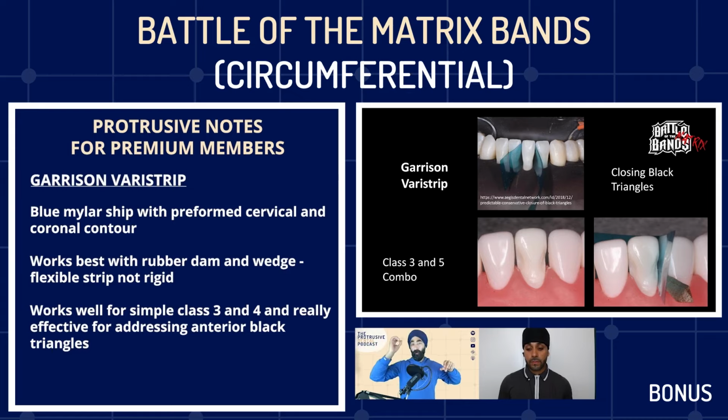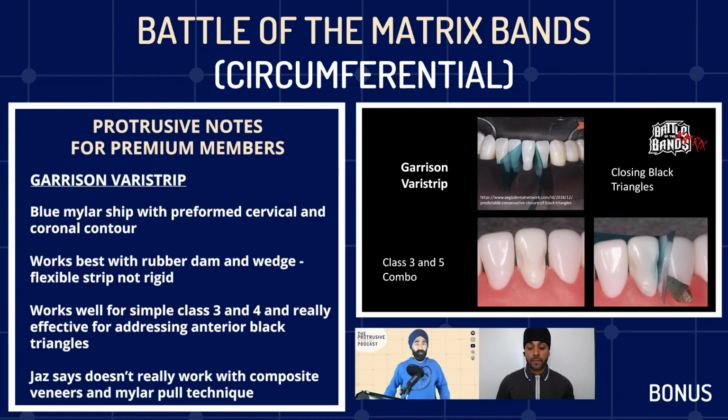So for my composite veneer work, I actually like to put the straight, clear mylar and then just pull it straight. That makes sure that I don't get too wide of an embrasure. So that's been my experience. Generally, class 3s, good, but for composite veneers and the mylar pull technique, in my hands, this doesn't work. I don't know what you want to comment on.